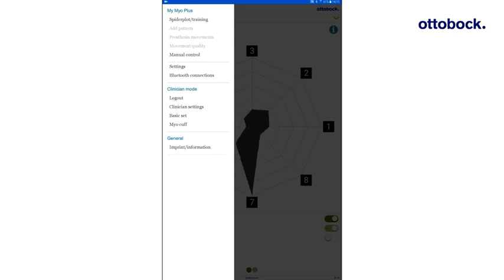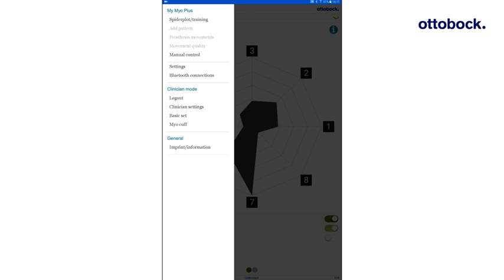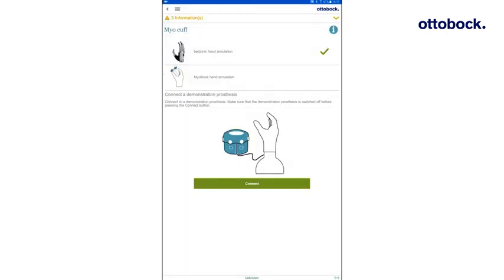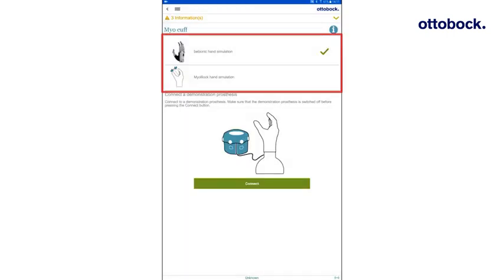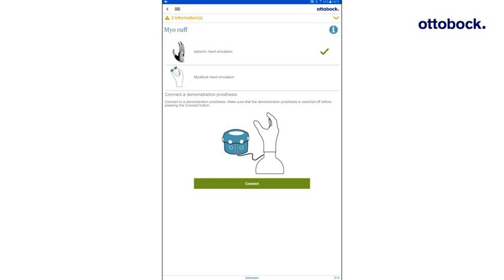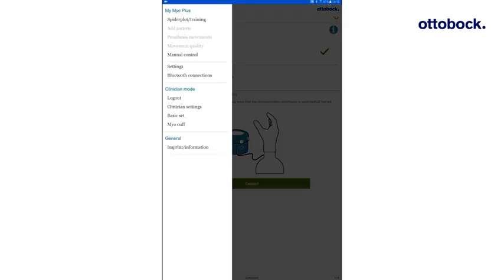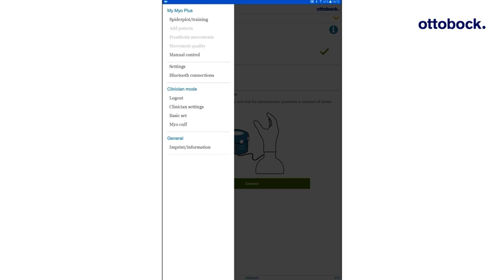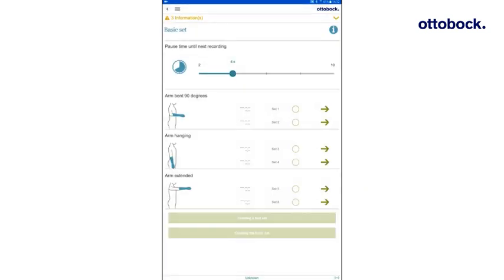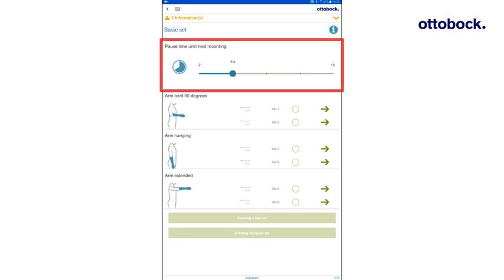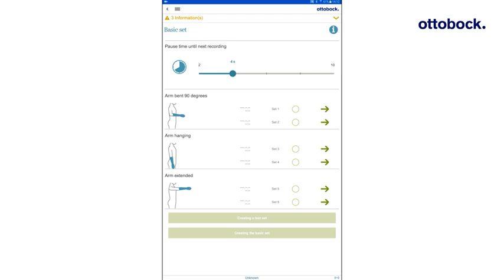Before recording, navigate to the MyoCuff menu and select whether a MyoBox or a BeBionic hand is to be displayed and simulated. To verify if the previously selected movement patterns can be separated by Myo Plus, they have to be recorded in the menu Basic Set. Adjust the pause time between the individual movements. Within the pause time, the user has to prepare for the next movement. A longer pause time is recommended for new users.